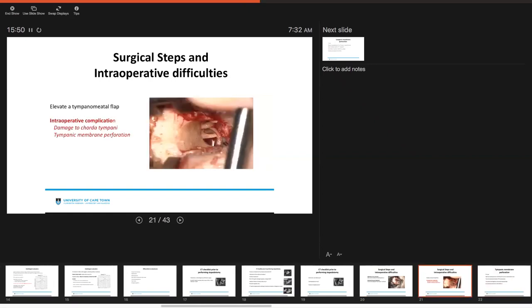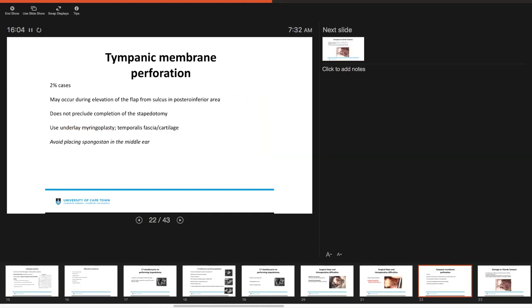You want to elevate your tympanomeatal flap. At this point, the intraoperative complication you may experience is damage to the chorda tympani once whilst raising the tympanomeatal flap or even a tympanic membrane perforation. The tympanic membrane perforation occurs in around 2% of cases and it may occur during elevation of the flap in that posterior inferior area from the sulcus. But it doesn't preclude the completion of the stapedotomy.